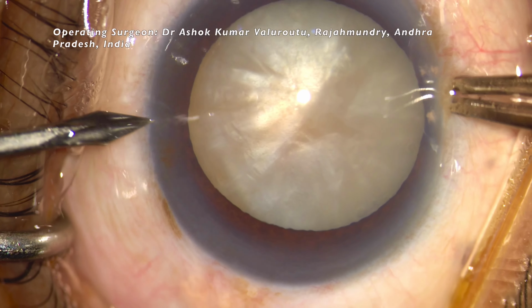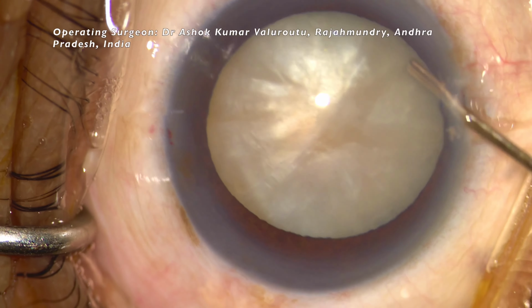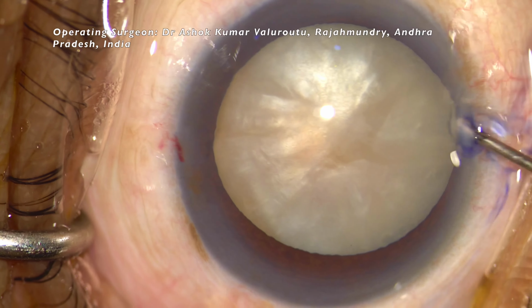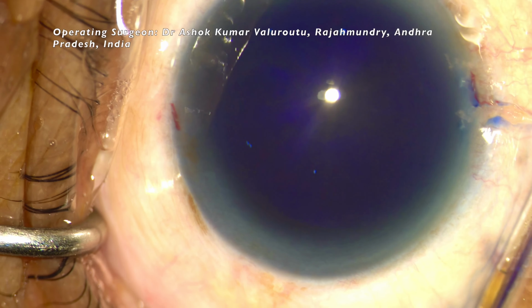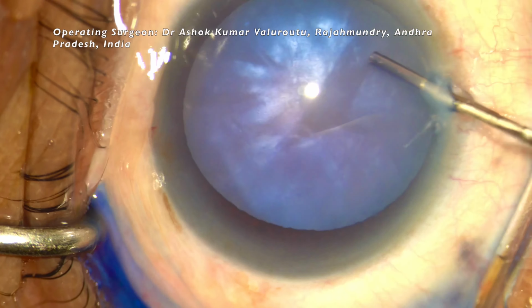Hello guys, this is Dr. Ashok Kumar. This is a case of phaco in a hypermature cataract. This case is a nightmare for any phaco surgeon because in hypermature cataract the intralenticular pressure is very high.